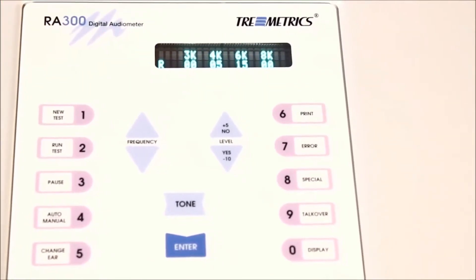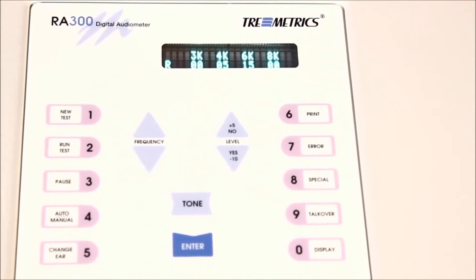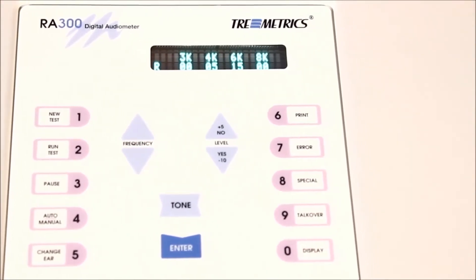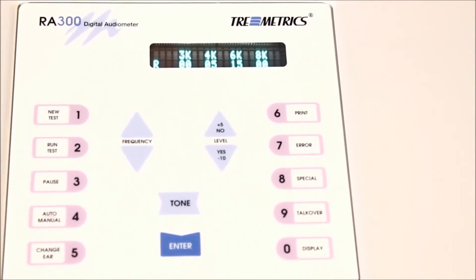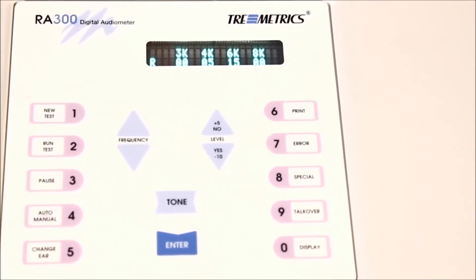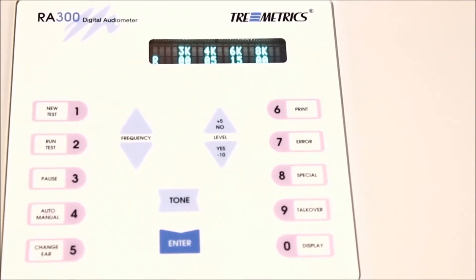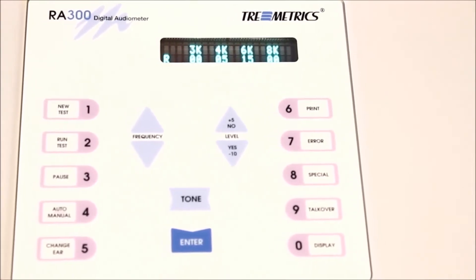This device also has a serial output, and you can send these results to a printer or to various software packages, in particular HT Pro from Workplace Integra, the HearTrack Audio and Hearing Conservation software system, as well as larger integrated systems like OHM Pure Safety and Medgate.